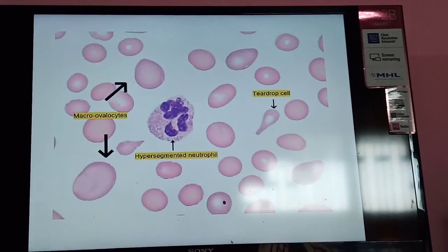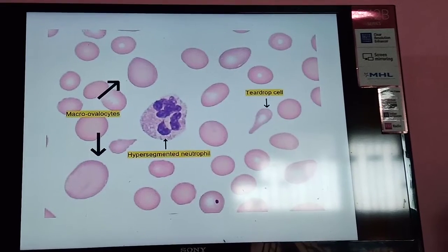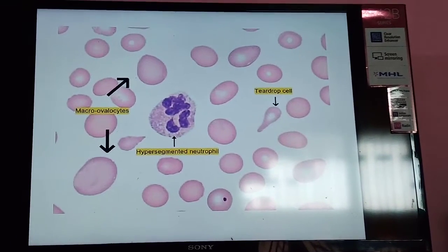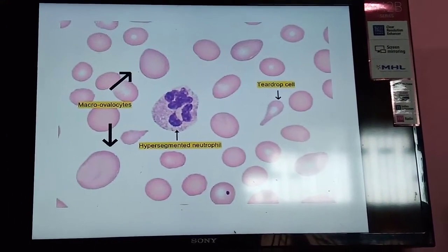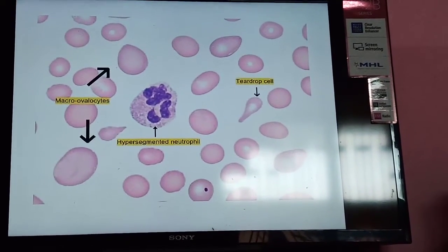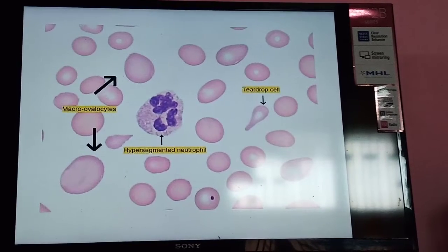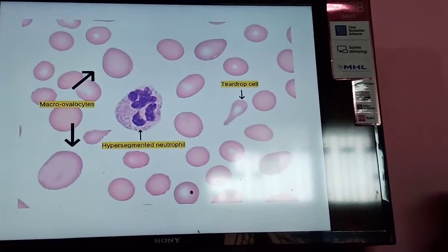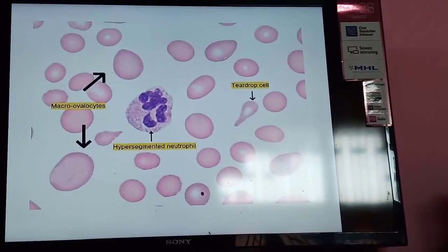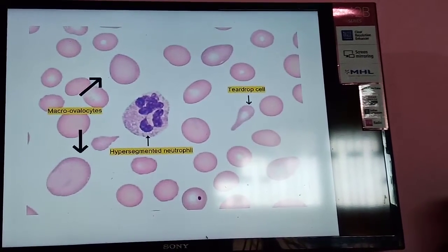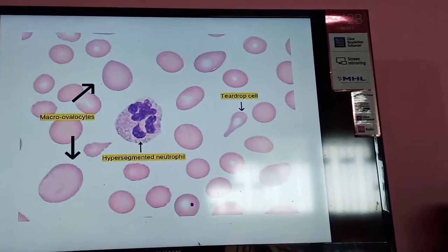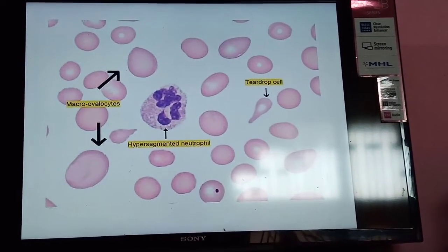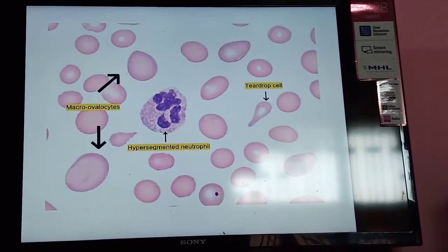In macrocytic anemia, hypersegmented neutrophils are a key finding. Normally, neutrophils have 2–5 lobes. If more than 5 lobes are seen in more than 5% of neutrophils on a peripheral smear, they are called hypersegmented neutrophils. RBC size is more than 8 microns, appearing as macrocytes. Teardrop cells may also be seen. These are the blood picture features of megaloblastic or macrocytic anemia.